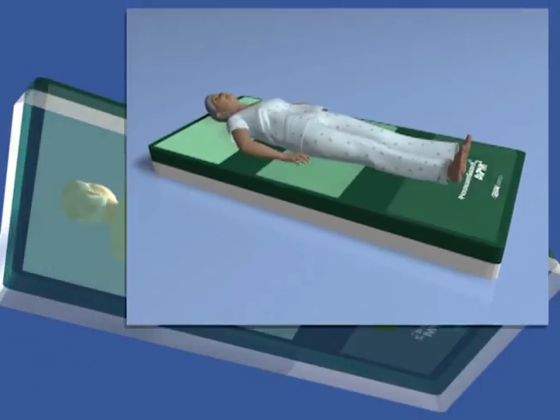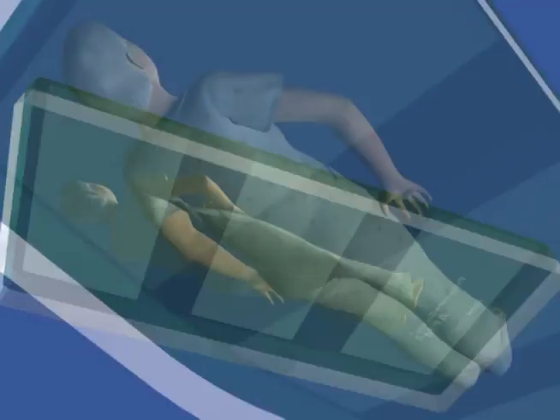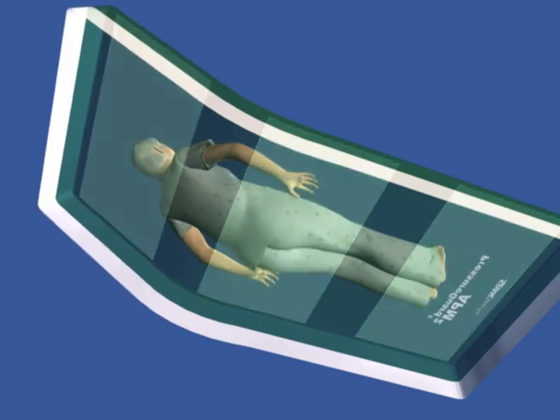Lifespan is extremely durable and cleanable, and delivers outstanding resistance to chemical breakdown caused by bleach and other harsh disinfectants with its polycarbonate fortified coating. Beneath the scapula, sacrum, and heels lie the shear minimizing bands of the innovative shear transfer zones.